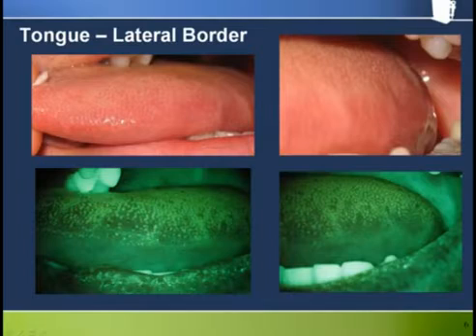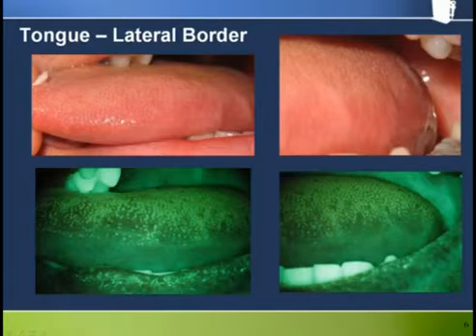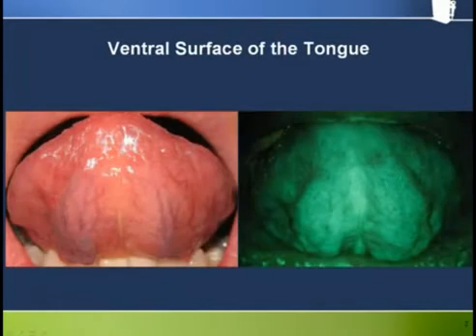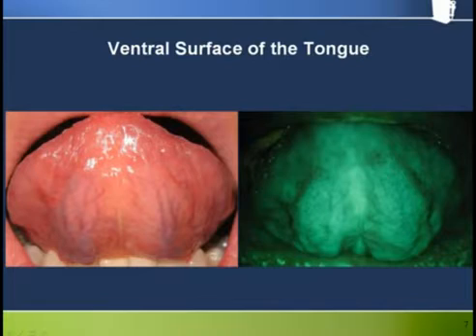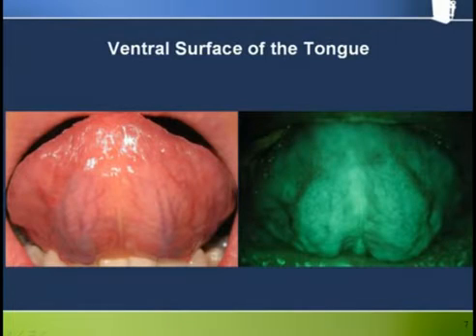The tongue lateral border proper looks quite bright and unremarkable. This is a nice view of the ventral surface of the tongue, again presenting as generally bright. Nothing of much concern here.